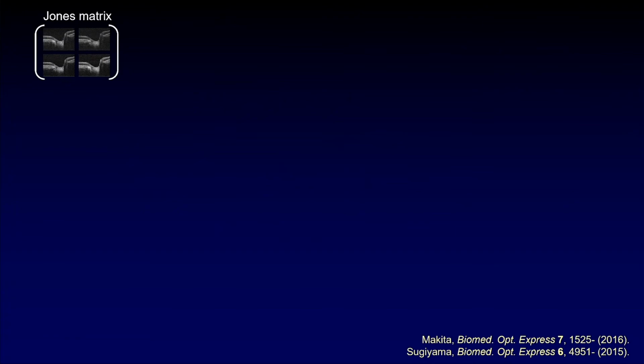Okay, and once we measure it, we can derive clinically useful features by applying the proper mathematical, say numerical, operators. That's the conception of the Jones matrix: measure the most generalized quantity and then derive a specific quantity afterwards, after detection. Actually, this is the initial conception of our current research of computational augmented optical coherence tomography. But anyway, this one is a very early demonstration.